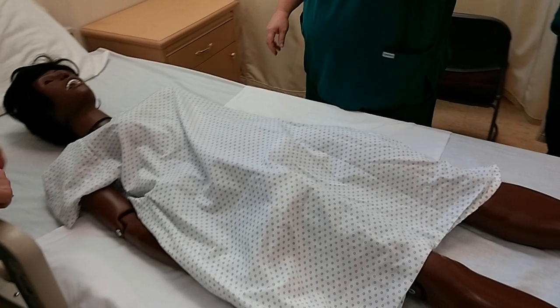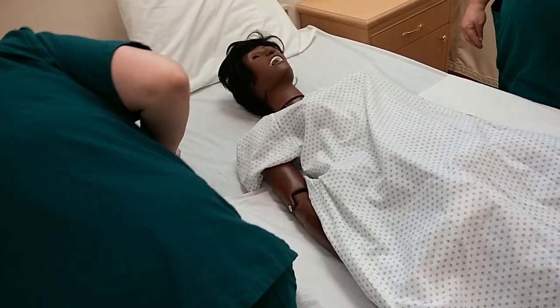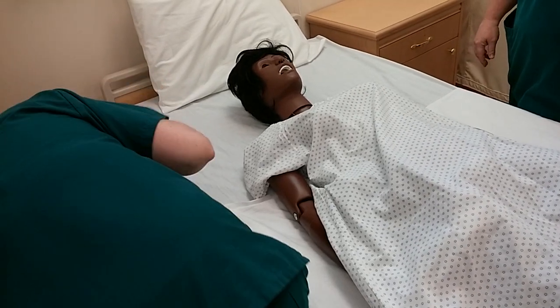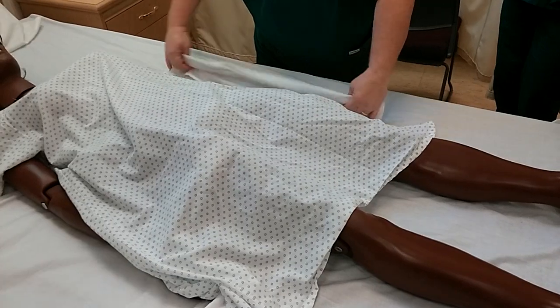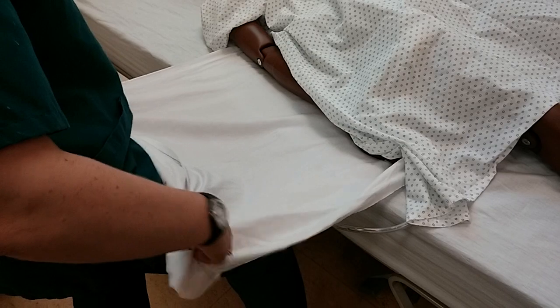Go ahead and take the side rail down. Now, take and roll the turn sheet up as close to the person as possible, not touching your uniform.